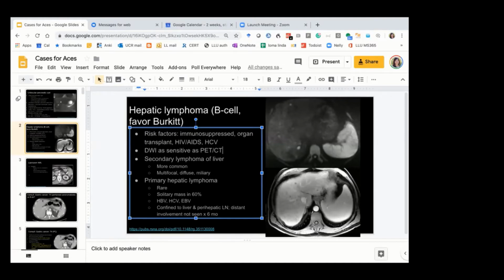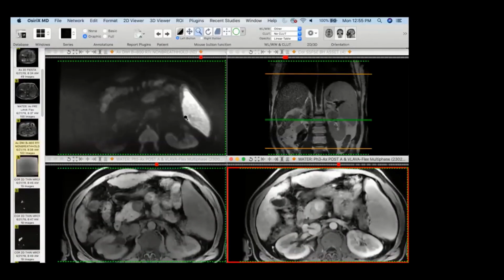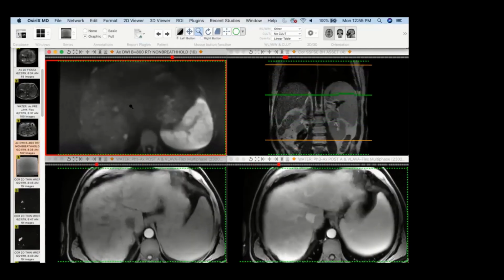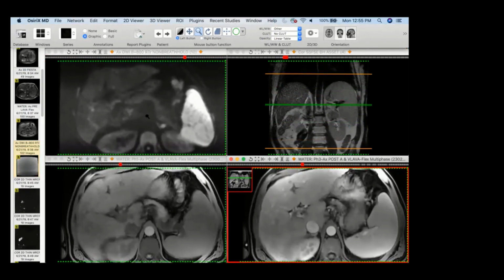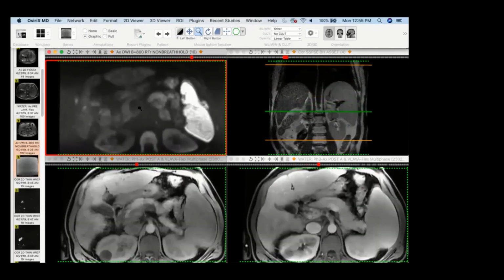I wonder if the thrombus was related to congestion though. Maybe there's a lot more infiltrative lymphoma in the liver because usually we're only seeing the tip of the iceberg. And then maybe it was congested, and that's why the portal vein thrombosed. Yeah, that's a very good possibility. And on the DWI, there are a lot more lesions than we can see on the contrast enhanced phase. So yeah, maybe congestion could be the reason for the portal vein thrombosis.